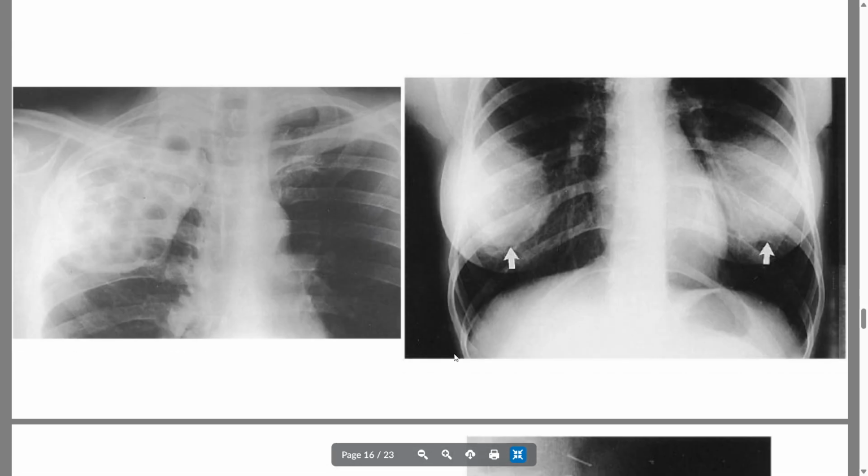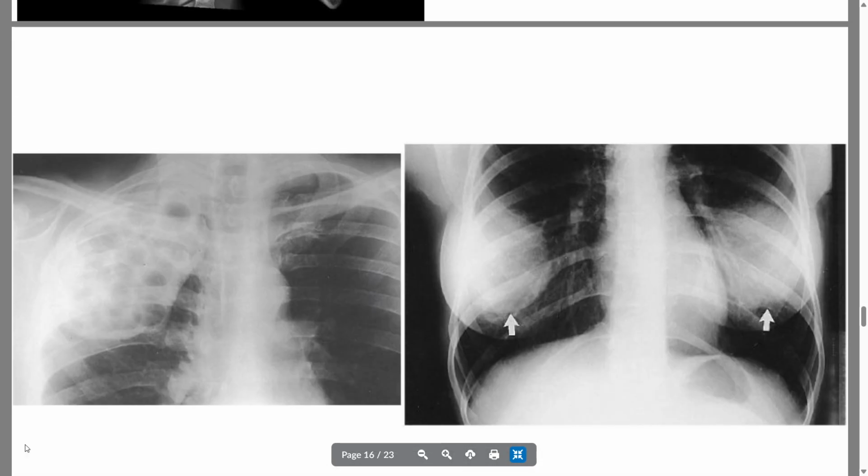In the chest, here on the left, we have the mediastinum here, which is pretty normal. We're not catching all of the heart, but that's where the heart is, and the aorta is coming around here. Normal lung on this side, and then we have lung here, and then this big radiodensity with all of these little circles in it. So kind of a weird one, but it's a very classic presentation.